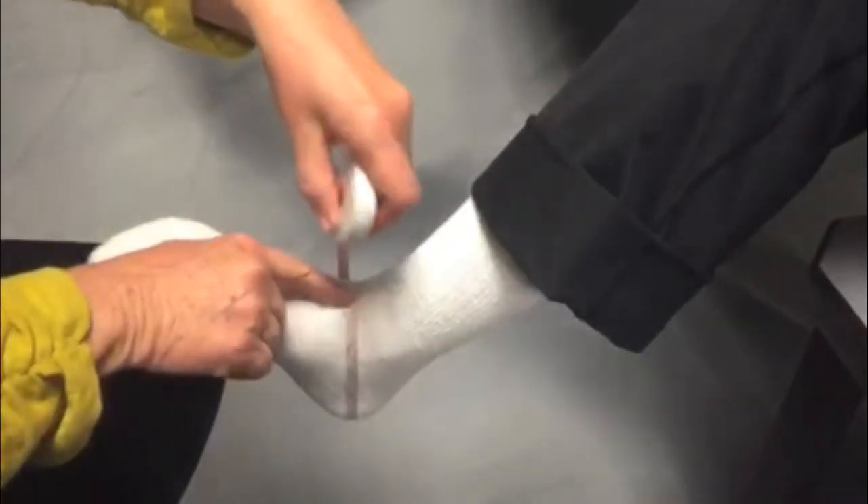Step number one is to choose the correct size ankle brace. Use a cloth tape measure to measure the circumference from heel to ankle.